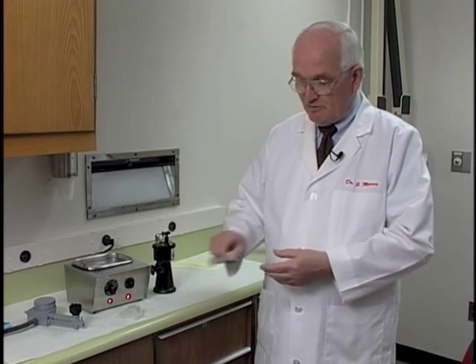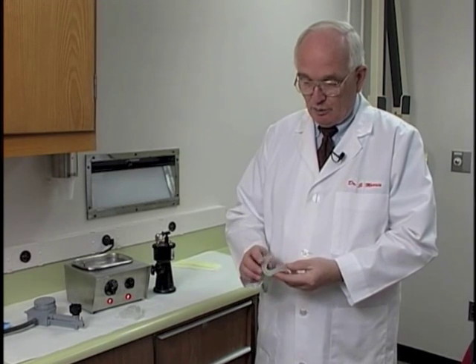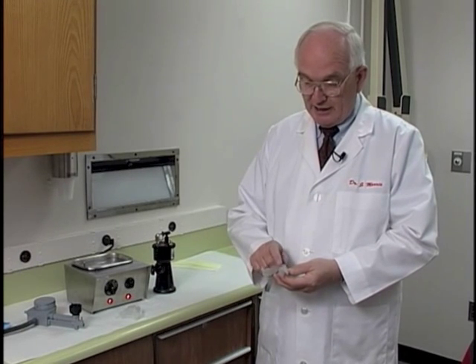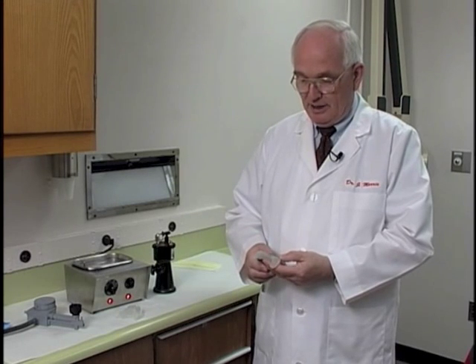Likewise, we'll be doing the same thing with a mandibular, and this is the tray that we constructed for the mandible, and we are going to be fitting that into the mouth and adjusting peripheries. Following that, we will be perfecting all of the peripheries with a material called modeling compound. This is all done prior to actually making the final impressions.